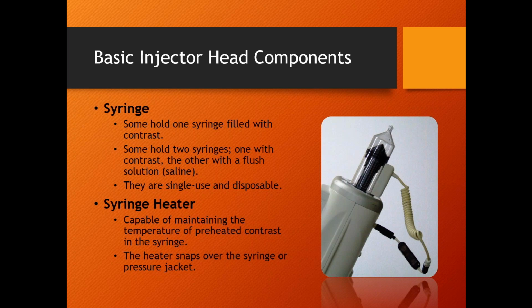So I'm going to lock the protocol so it can't be changed, and then arm the button. And then whenever they go to arm the injector, this is that moment I was talking about earlier, they have to tell the injector that they have checked for air. There's always a reminder when you go to arm the injection, meaning we're getting ready to shoot it. Arm the injector, a window pops up in some form or another saying, have you checked for air? They have to hit yes.